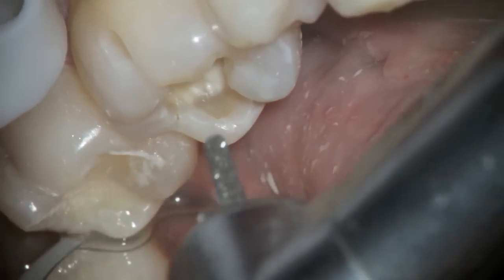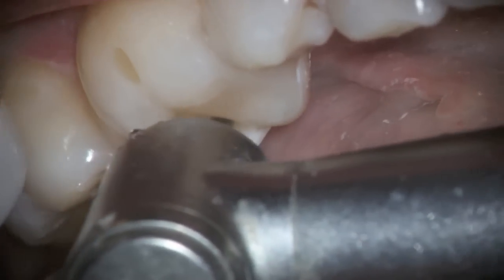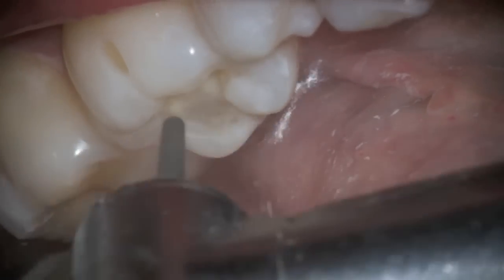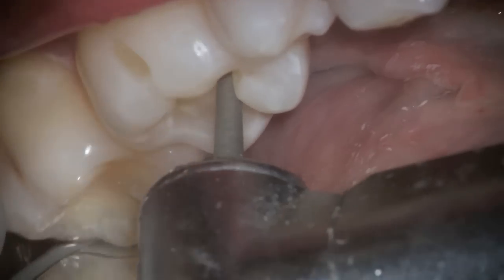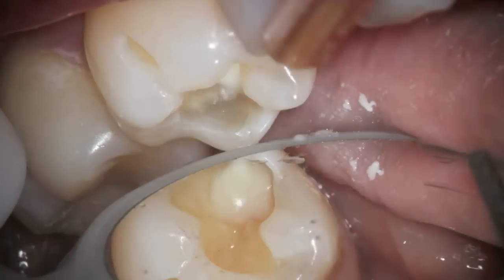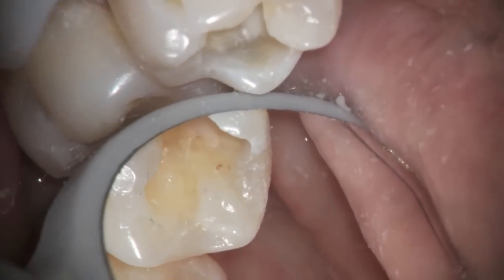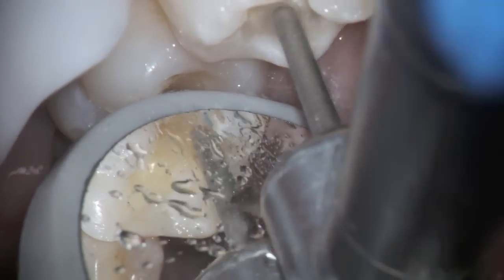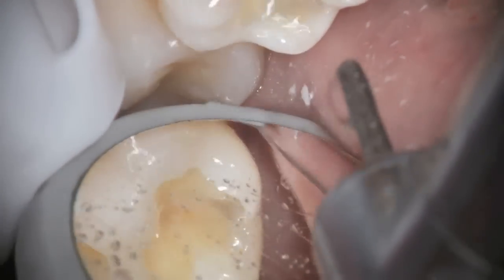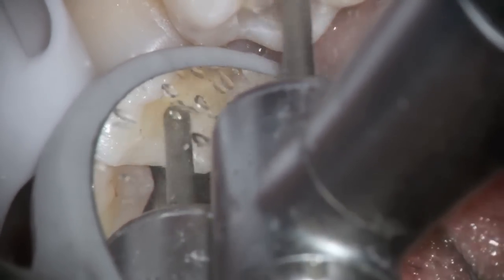That will give us a baseline for when later on there seems to be a problem. There was decay up underneath the cusp as well, so we make sure that we have everything nicely polished and the decay removed — it is a thin wall. When we're finished we'll check the occlusion. I notice a little spot that appears decayed, and with everything having been decayed before, it makes more sense that it is. So we go in and remove that. As you can see, this is where the mirror came in very handy — we were able to go in and remove it because you wouldn't normally see that spot.